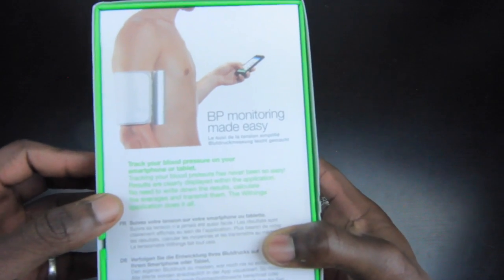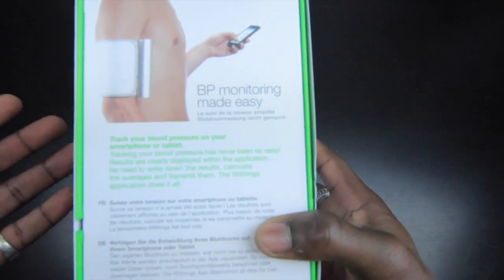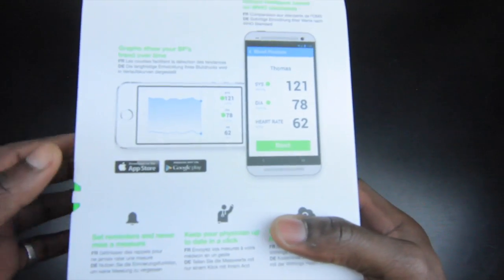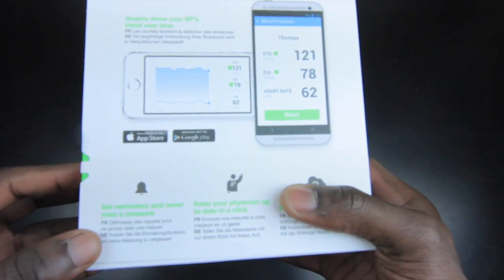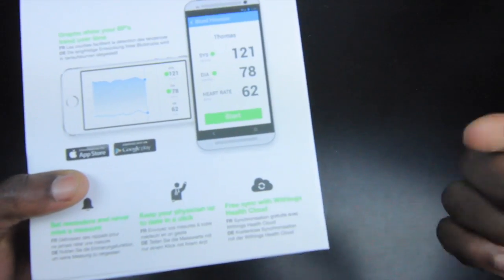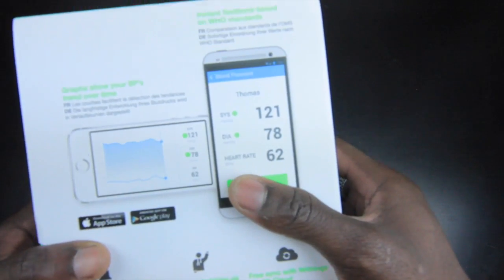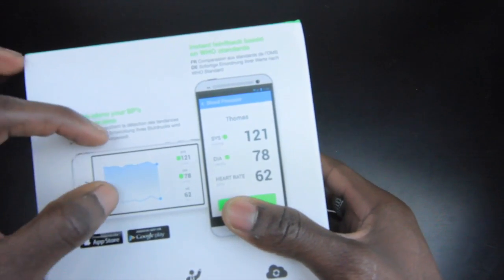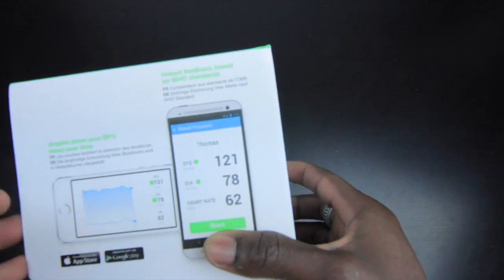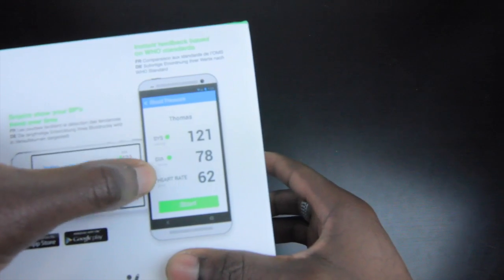It's made very easy because it can track your blood pressure on your smartphone or tablet, iOS or Android. The great thing about the app is you can send your results to your doctor via email, set up reminders so you never miss any checkups, and you get free sync with the Withings Health Cloud. You also get graphs to show trends over time, and it gives you instant feedback based on World Health Organization standards, showing your systolic, diastolic, and heart rate.